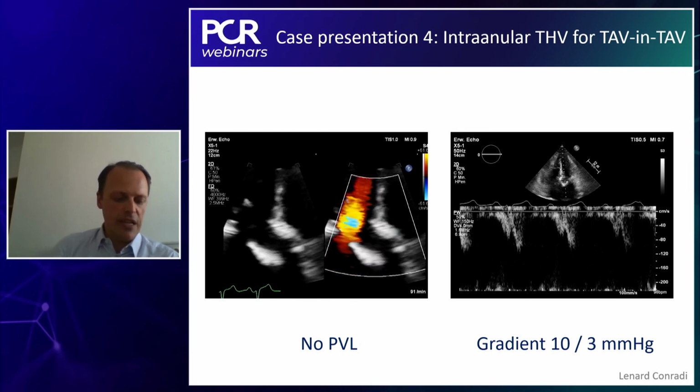Okay, so we're done with this case, and we have just a few more minutes to discuss this one or the overall topic. I see that there is one comment from the chat, which I can read out. Robertas Pranevicius says, a useful tip which we use is to put the last TAVI projection into the protocol so that the operator, who will get the patient at night, would know where to start. Not a bad suggestion. This would be a practical suggestion. I like it.